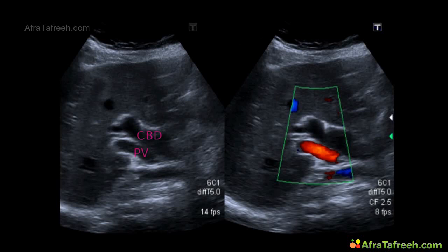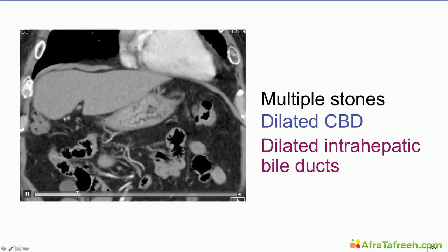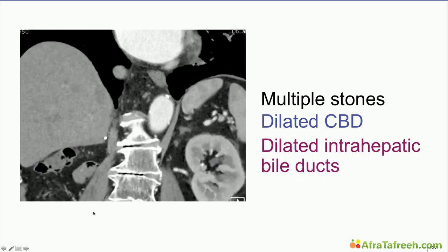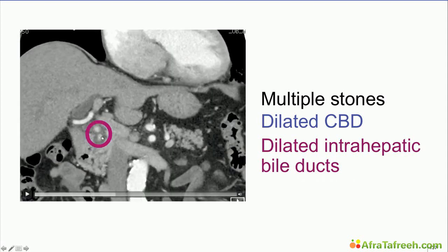But what's the reason? We couldn't find it in our ultrasound examination, so we performed another imaging modality and found gallstones in the very distal common bile duct. And I'll show you this over here. Common bile duct and a lot of concrements in there, blocking the drainage of the common bile duct. So in this case, there was no malignant tumor, only some gallstones.